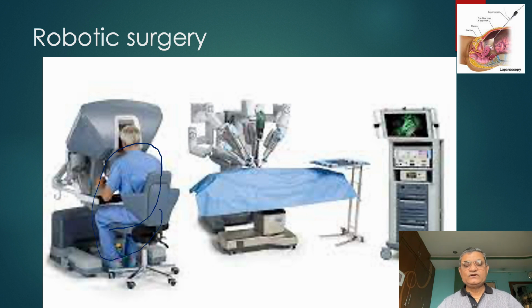In the da Vinci robotic surgery system, there is a console, and in front of the console the surgeon sits, and his hand movements are transmitted to a system in the operating room.